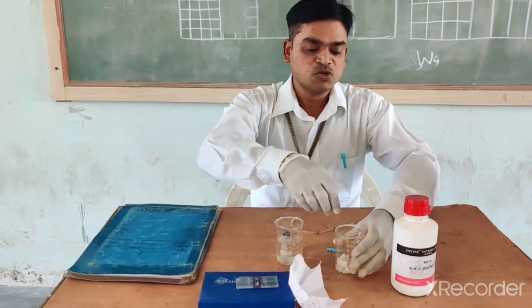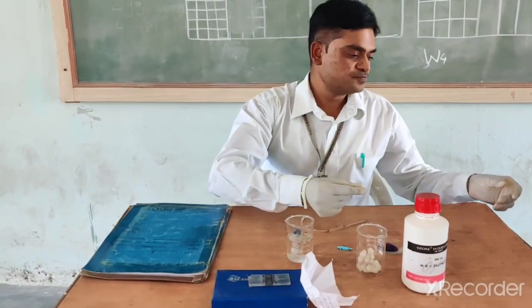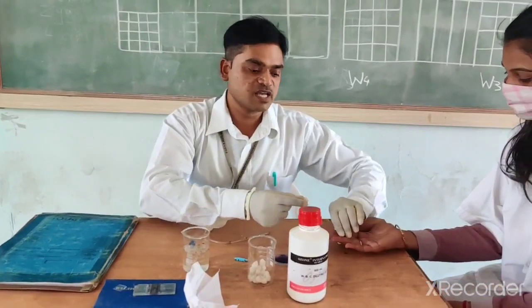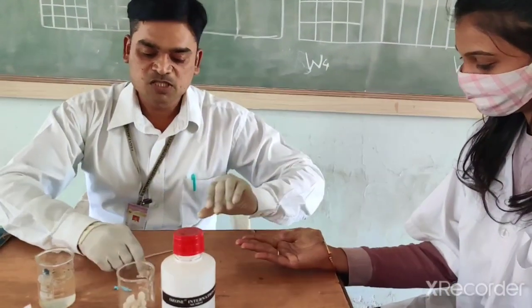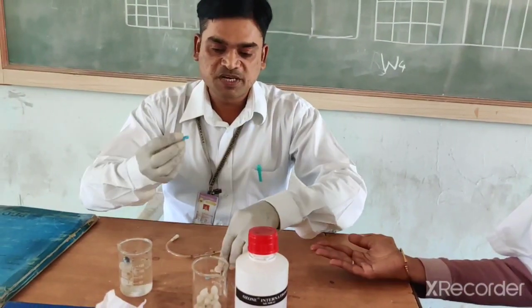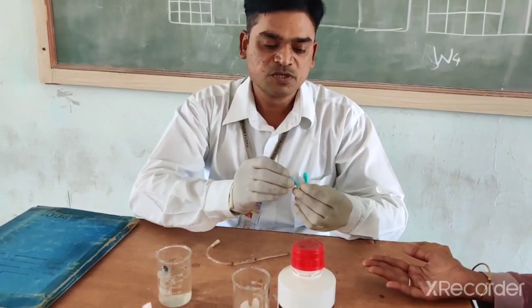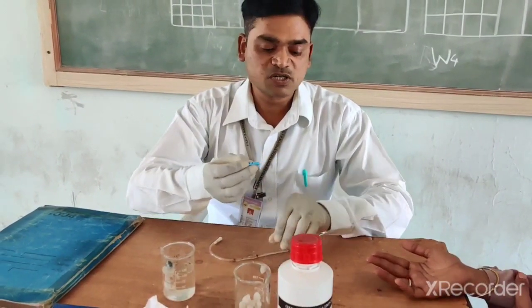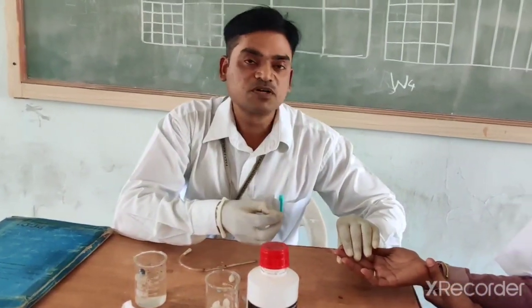For that, what we should do? We should take this cotton swab and sterilize the finger. Also we should sterilize the needle. We should use the pricking needle for pricking purpose and sterilize it properly so that no bacteria enters inside your body.